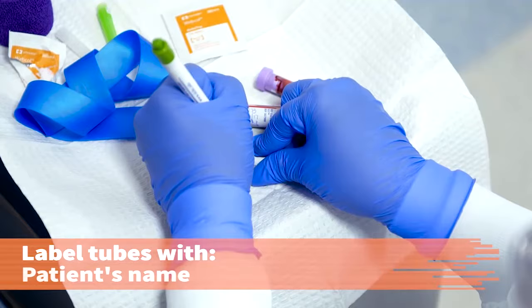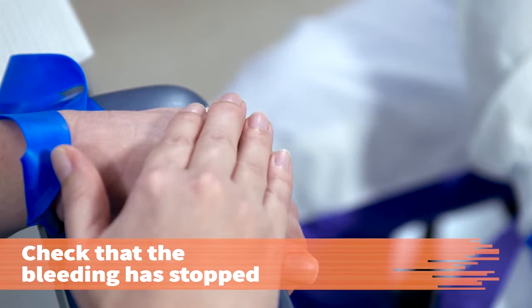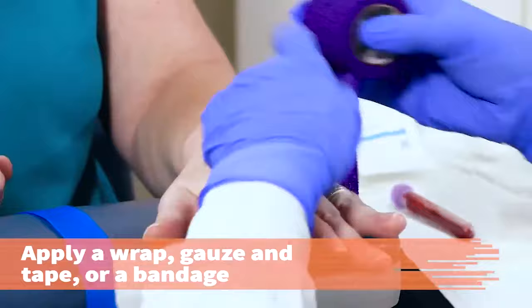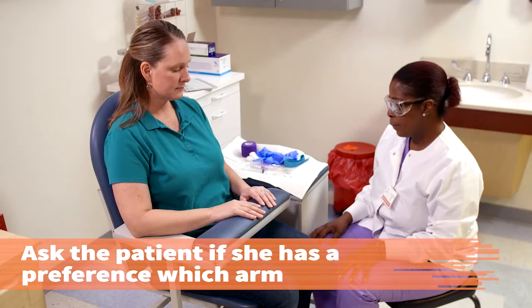While the patient is applying pressure to the site, label the tubes with the patient's name, date and time, and your initials. Or, affix the pre-printed tube labels and print your initials on the label. Check the venipuncture site to make sure bleeding has stopped. Let me take a look — alright, you've stopped bleeding. If you can hold it for just a second, I'm going to go ahead and wrap it up. Apply a hypoallergenic self-stick wrap, gauze and tape, or bandage. Wash or sanitize your hands.